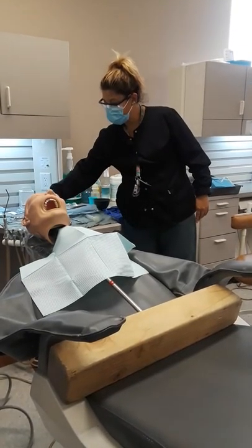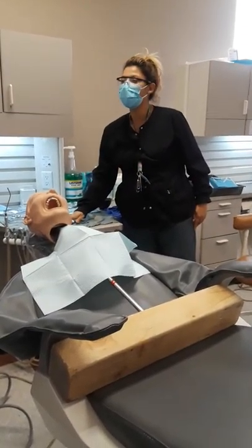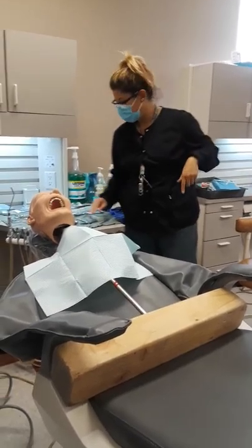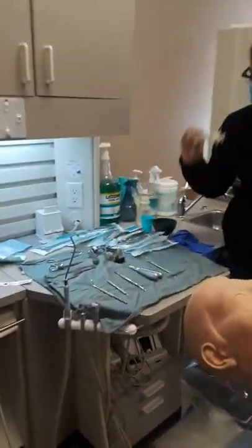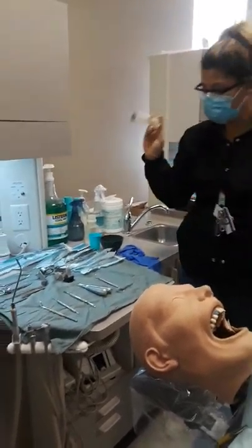My simple setup: my basic periosteal, two straight elevators — one skinny, one large — and my curette. And I have my irrigating setup.